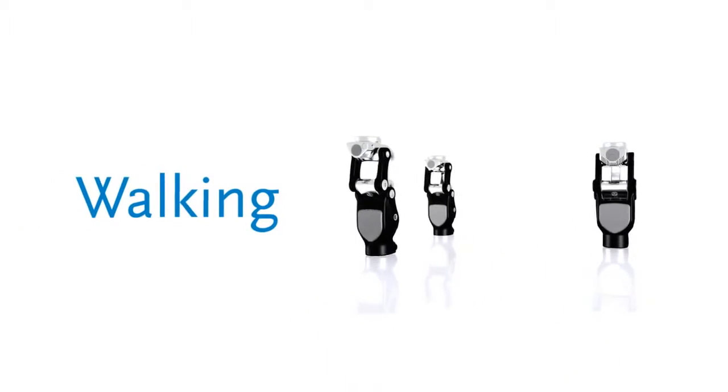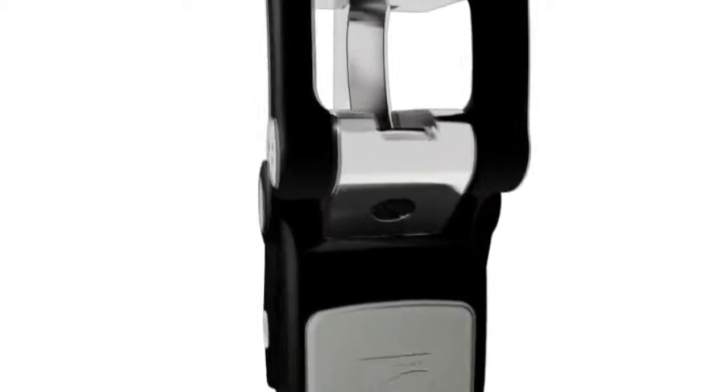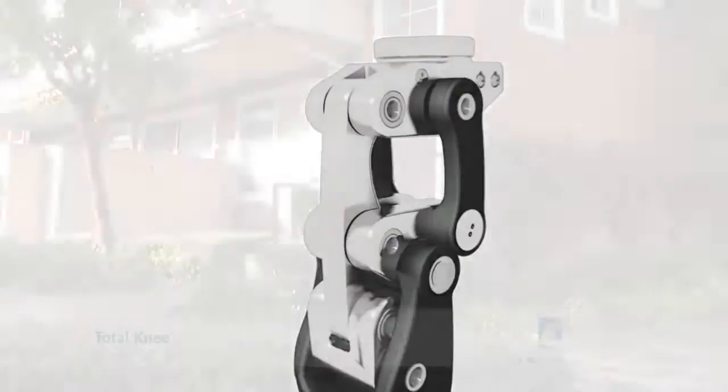Walking. The 7 axes of the knee work together in a way that will shorten the length of it while your foot is off the ground and swinging forward to take the next step.